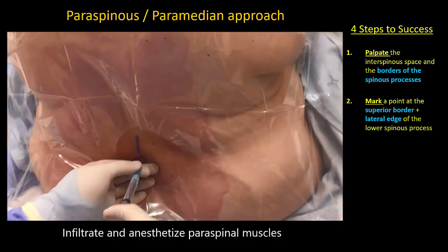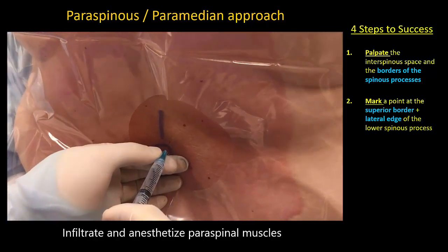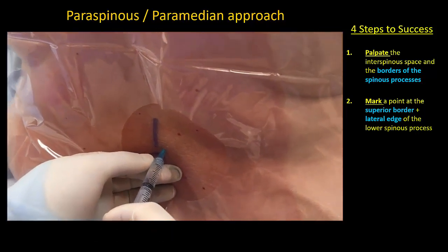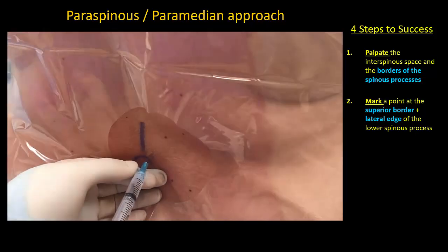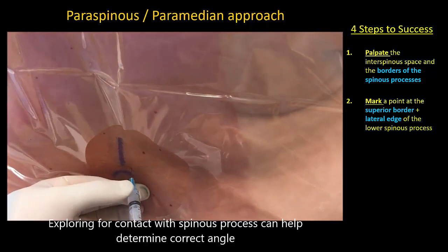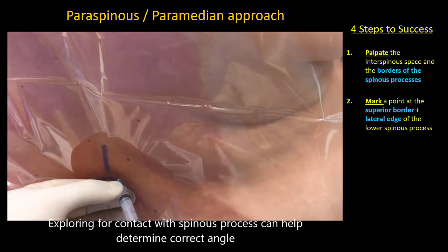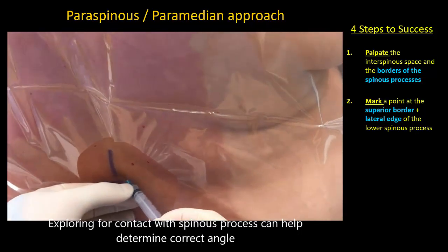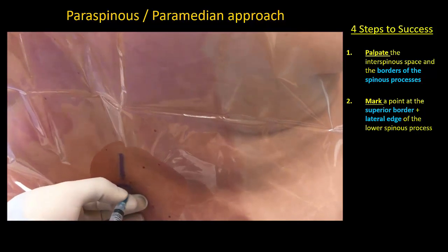Infiltrate the skin and the underlying paraspinal muscle. I recommend exploring the contours of the spinous process with the local infiltration needle to further confirm the best trajectory.